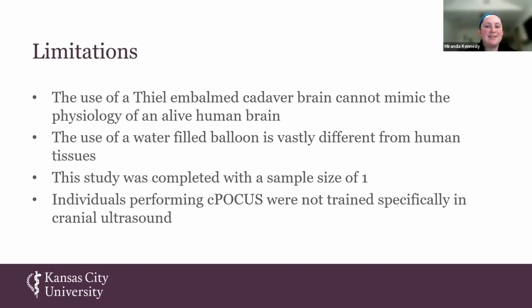There are several limitations in this study, including that a cadaveric brain is not an accurate imitation of the activity a live human brain would have, which also makes certain structures difficult to find on cranial POCUS. The use of a water balloon is also vastly different than real human tissues, and this study was only completed with one cadaver. And lastly, I'm also just a medical student, not classically trained in cranial POCUS, so that adds another complexity and limitation.